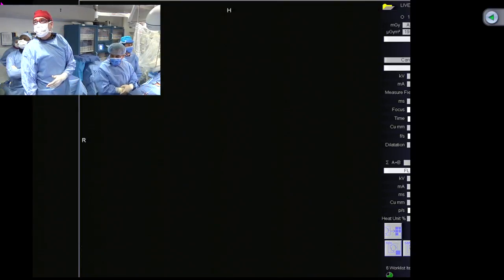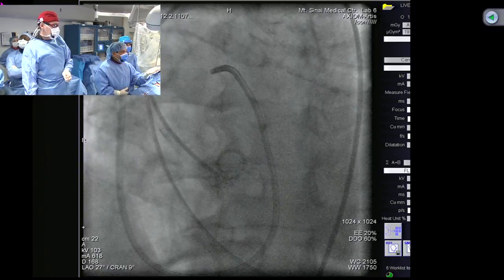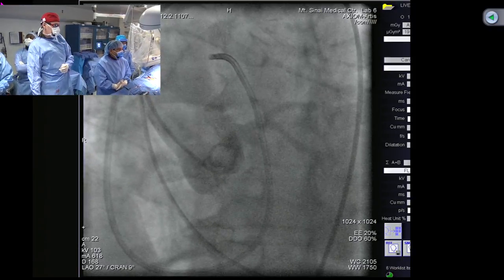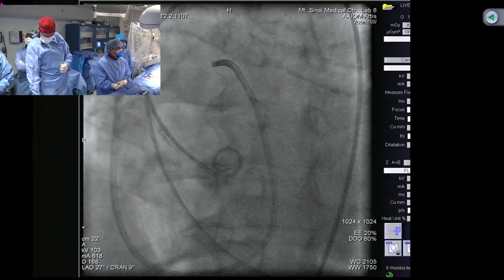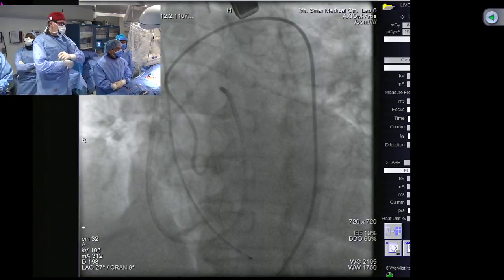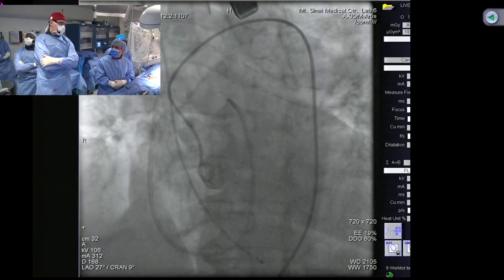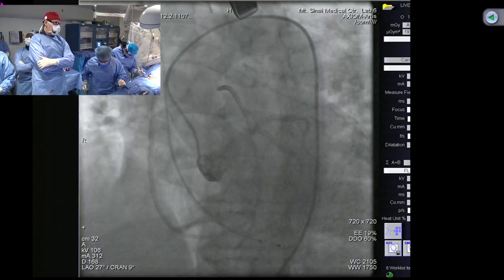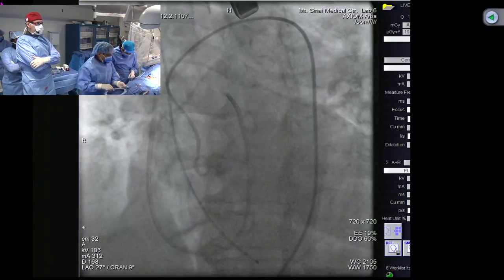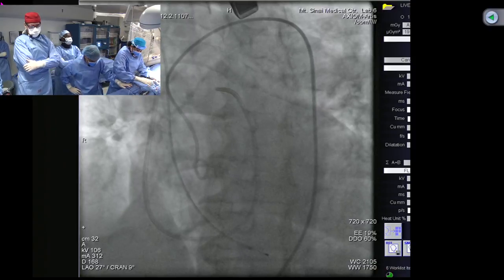See if we have anything which we can pick up on the aortogram different than before. To me, if you had to ask, I probably would say it's maybe a bicuspid valve, but usually bicuspid have very eccentric sinuses, but we don't. So angiographically, there's nothing unique which I would point out that would make us believe of this unicuspid on an angiogram. So we have crossed the valve now, with our AR2.